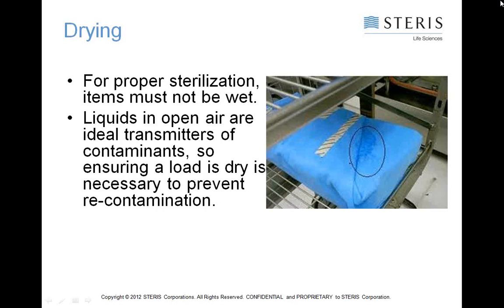We'll come back around. We'll be hitting these again as we look at the sterilization pipes and then some of the challenges. But let's take a minute. I want to talk about 3 basic sterilization types that we use in the industry. The first one is a gravity cycle. It's your basic sterilization cycle.